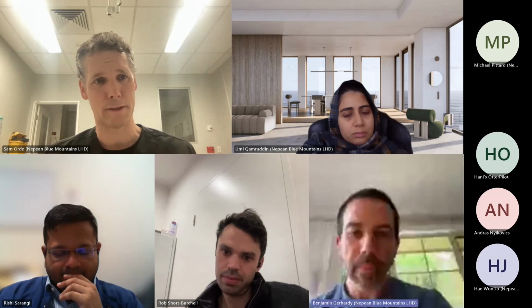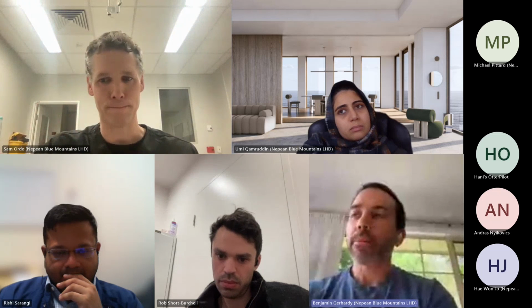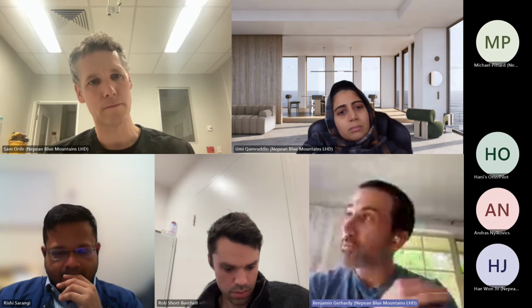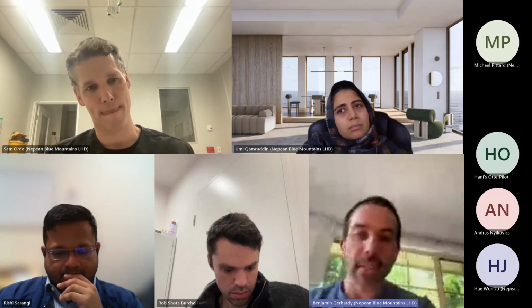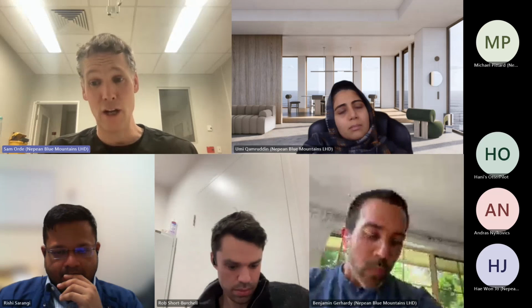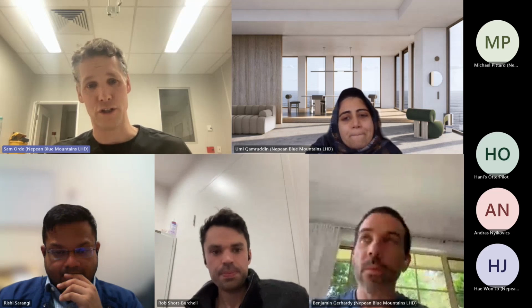No, just a very quick comment: when doing cardiac output measurements, remember that the LVOT diameter doesn't change. For people that are starting, if you measure 2.2 centimeters and you look back over past scans and it's been consistently 1.7, 1.8, 1.9, 1.8, you're wrong. What a great comment. And that's why in the critically ill, what I measure all the time is LVOT VTI, and look at how that changes, particularly with regard to myocardial function.